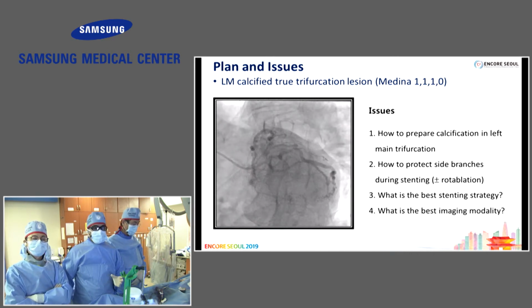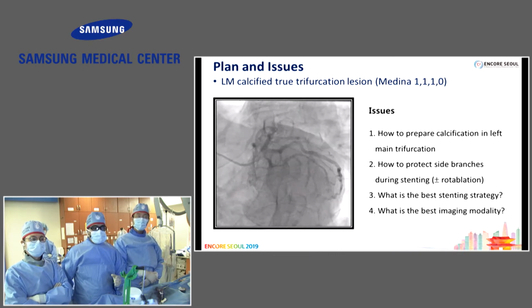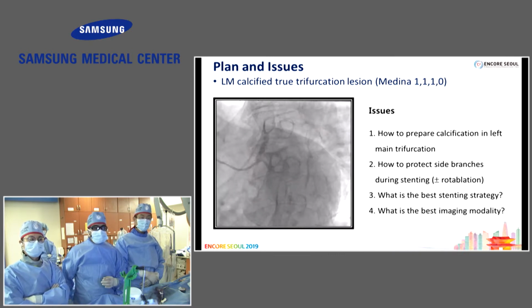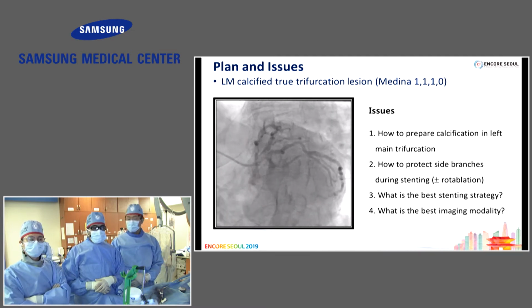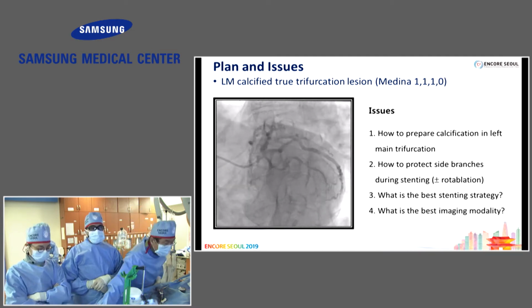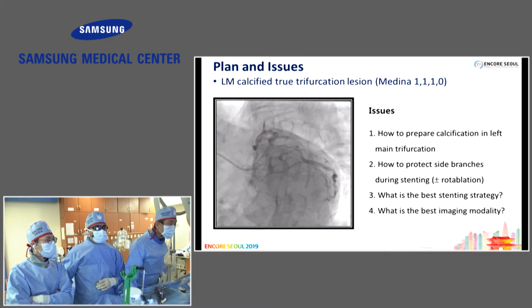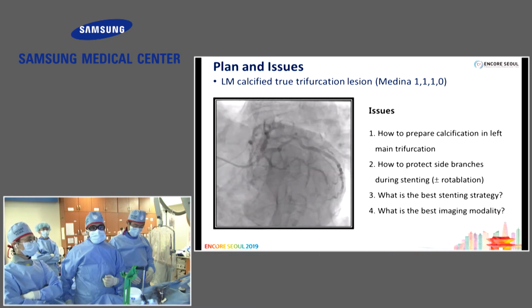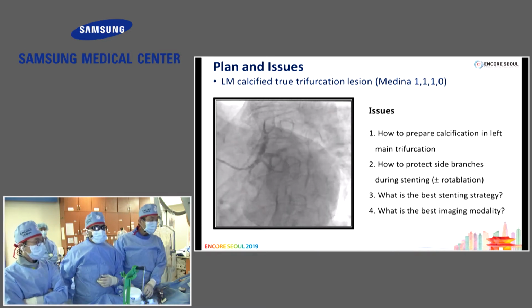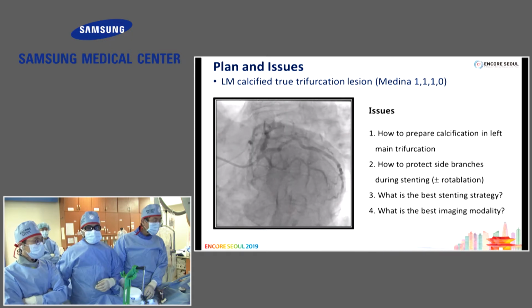We know the patient has severe calcification, but it wasn't clear whether the ostium of these lesions was severely calcified. We published clear criteria in 2017 about whether or not to perform rotablation due to the risk of underexpansion. So we planned to perform OCT, which allows us to look at the thickness of calcification in addition to the arc as well as the length of calcification.